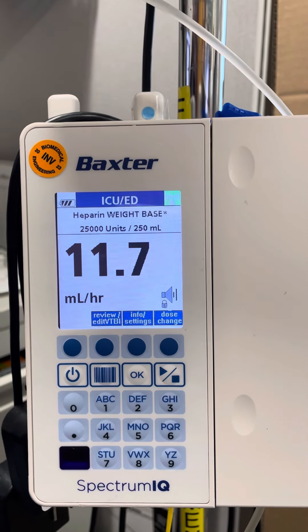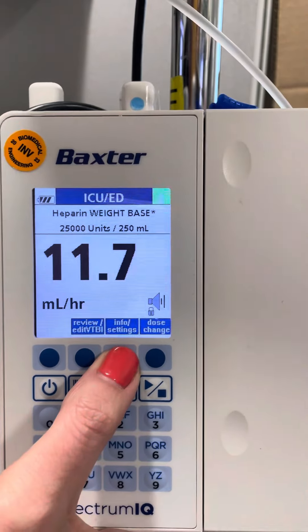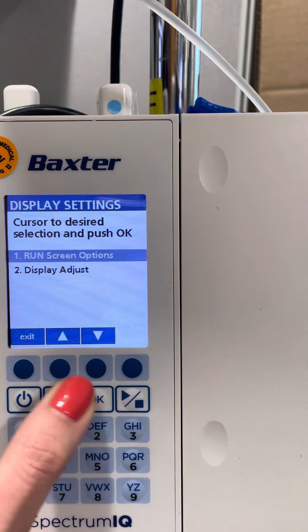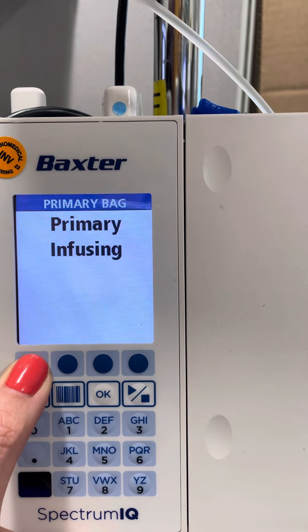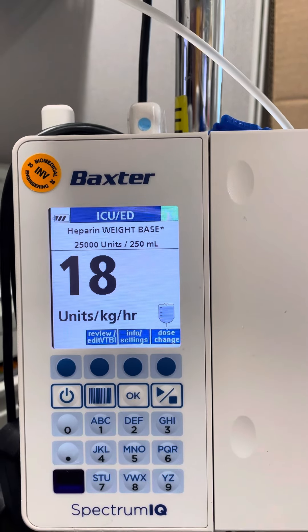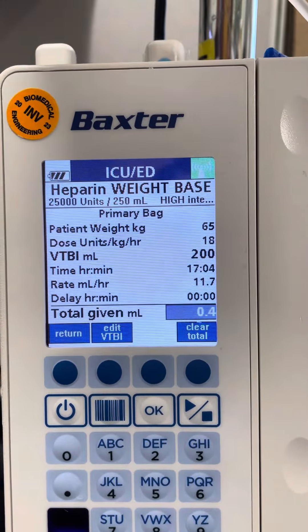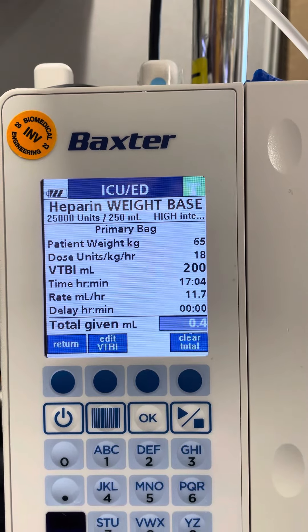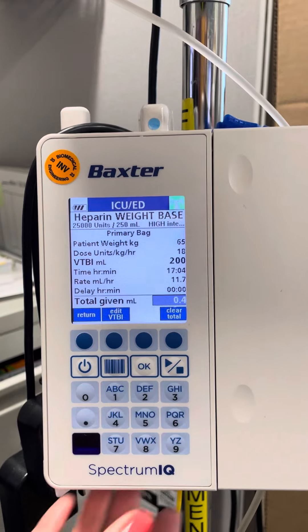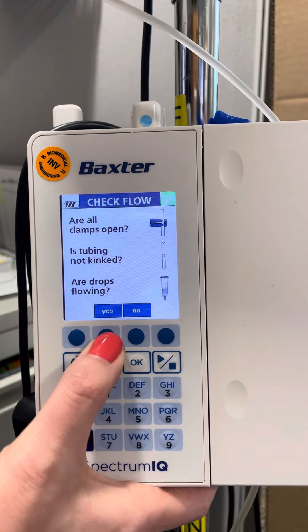But if we wanted the volume to be infused or the time left, we could just hit Review, and then we could get the time left and the volume to be infused. So it's not like the information is lost — it's just not scrolling. This might be a safer option.